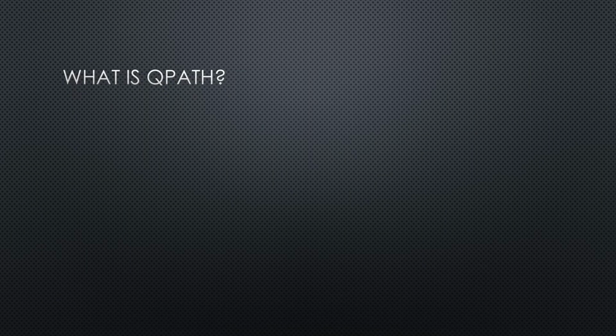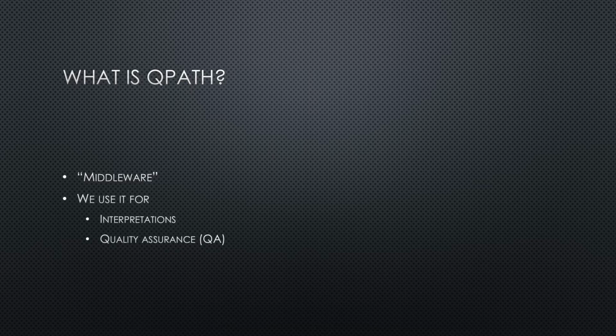So, speaking of QPath, let's talk about QPath a bit. So what is QPath? It's known as a middleware application. It's the interface between the ultrasound machine, the PAC system, and the EMR. In our current implementation, we only use it for storing and performing quality assurance on images for residents, but it also can be used to send those images up to PACs, which we do occasionally when there's a clinically relevant exam. In the future, we might use it for billing and credentialing and other processes, but this is what we use it for at the current moment.